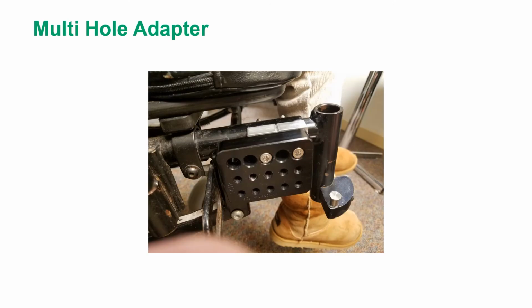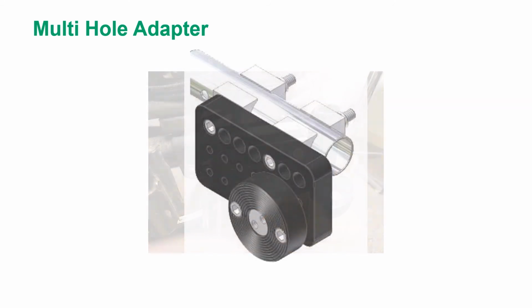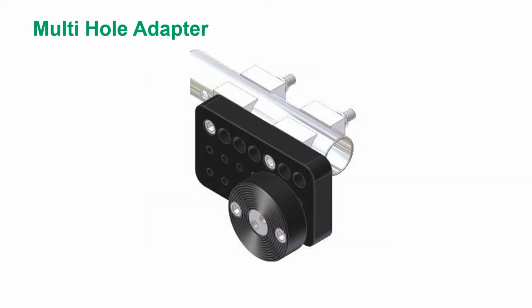In this picture, we see a multi-hole adapter in its final installed position. Let's detail the pieces of this frame inner piece. This inner piece is comprised of a multi-hole adapter, a piece that has multiple holes that can adjust to the available holes on the wheelchair tube.